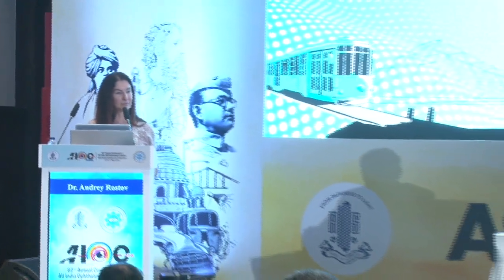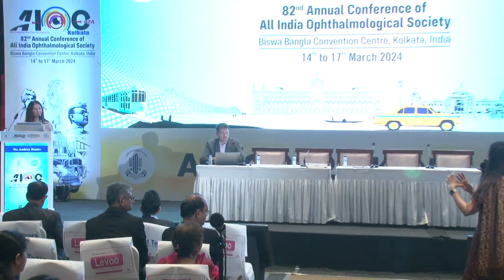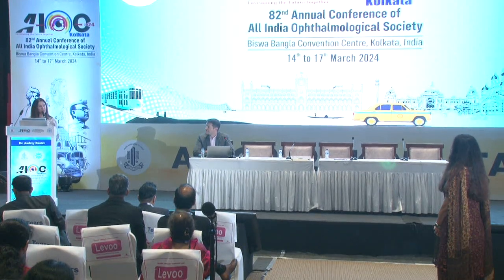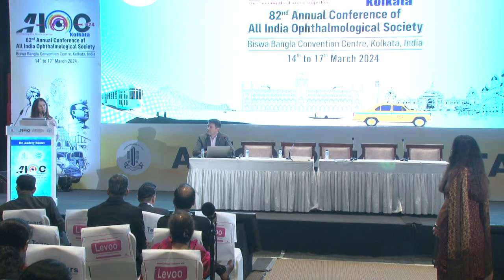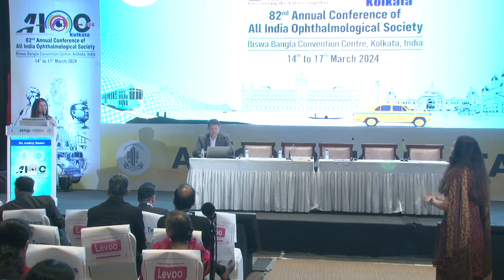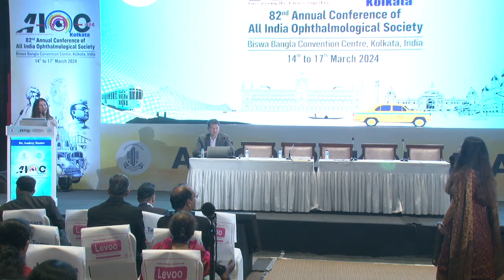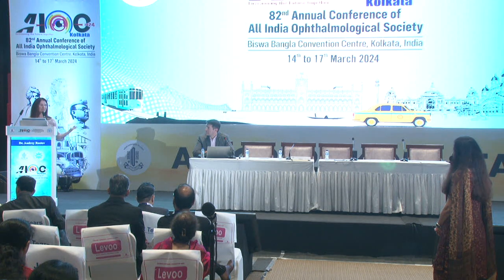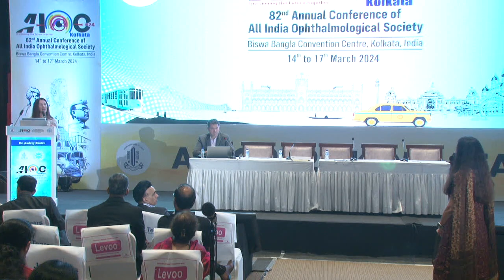My question is sort of post-operatively, fundus examinations, and what if they need retina surgery? Is that a big deal when you have the small aperture lens? As long as they dilate well, the answer is no. And I discussed this with some retina colleagues. You have to make sure the patient can dilate well. If they don't dilate well, or there's any concerns, like if they have macular pathology preoperatively, that case I showed, then I'm not going to put one of these in. However, if they have a normal macula, they dilate well, then I don't think it's an issue.